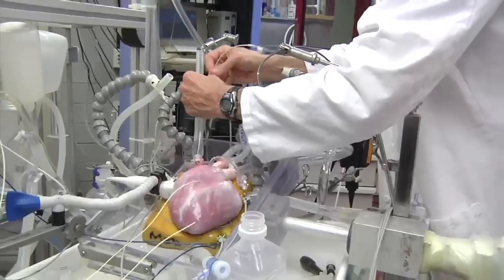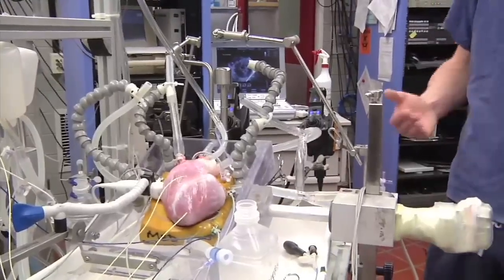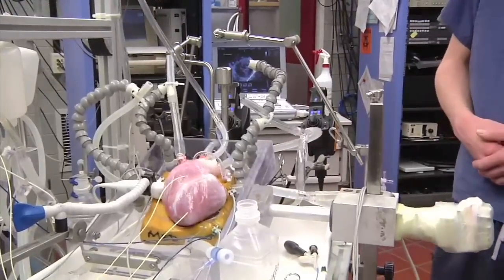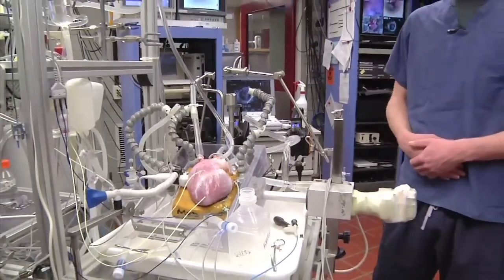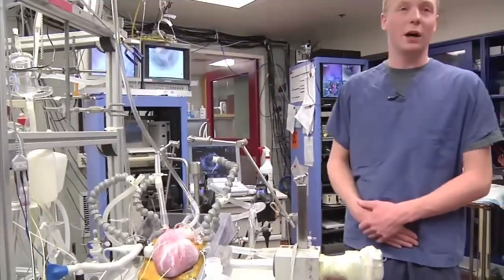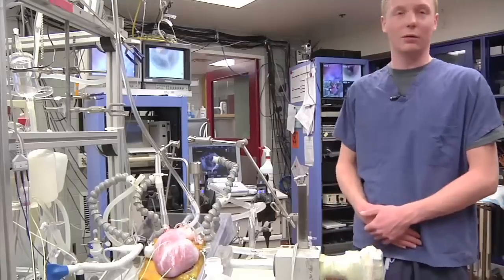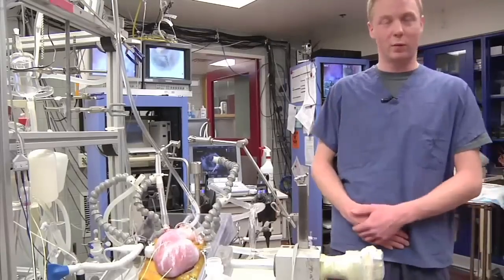All these are market release leads. There's a lot of cardiac devices now that come in and sometimes affect the conduction system. So we're interested in looking at how those devices actually interact with the heart and how they affect the conduction system. We'll do one heart a day to study, so the heart will last 4 to 5 hours. We're able to do a number of different studies on one heart.